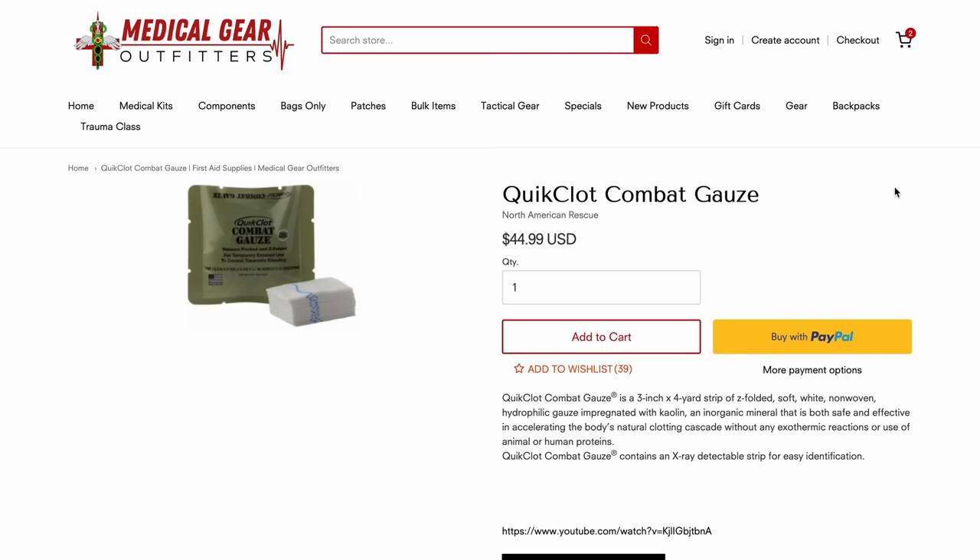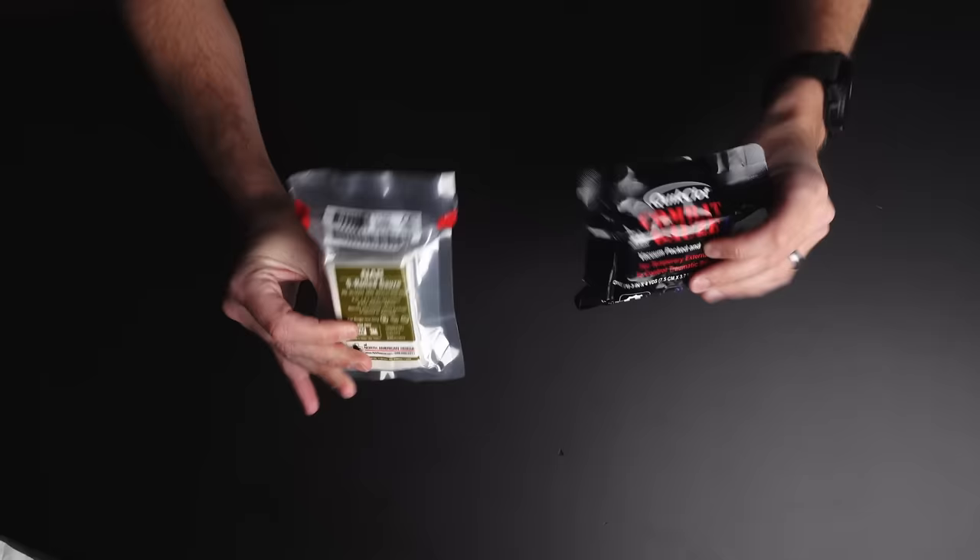First and foremost, the first thing I would put in any kit is some kind of packing gauze. You can go with QuickClot gauze just like this, or plain packing gauze. The survival rates between these two are very similar. While QuickClot is the gold standard, if you can't afford the $44 or $45 it costs, plain packing gauze will run you about $4. So there is a big price difference but they do almost the exact same thing.